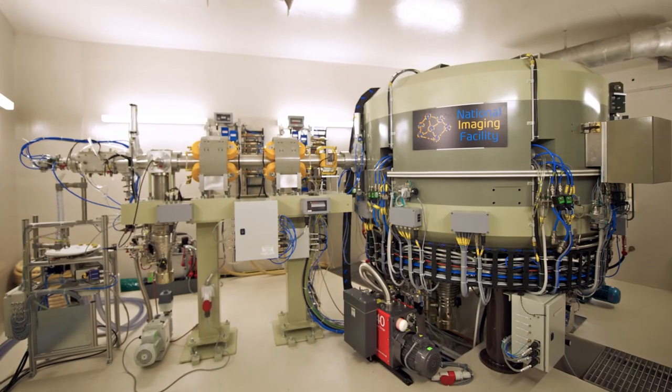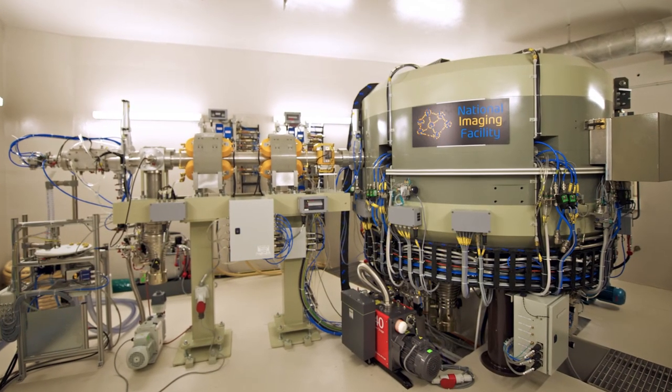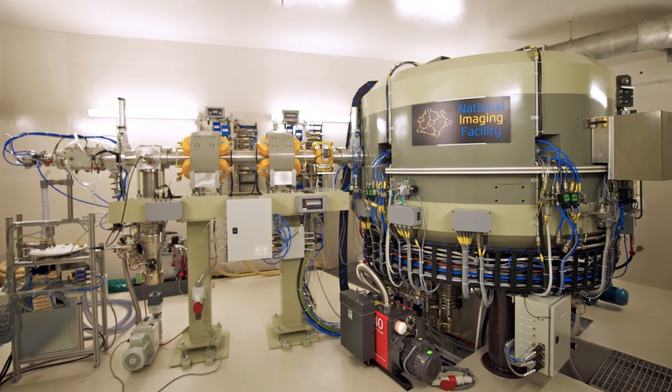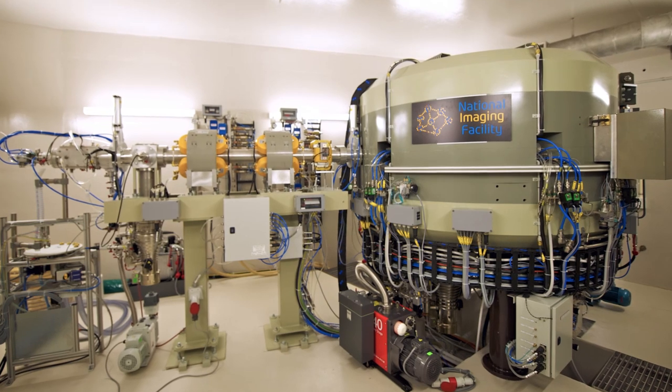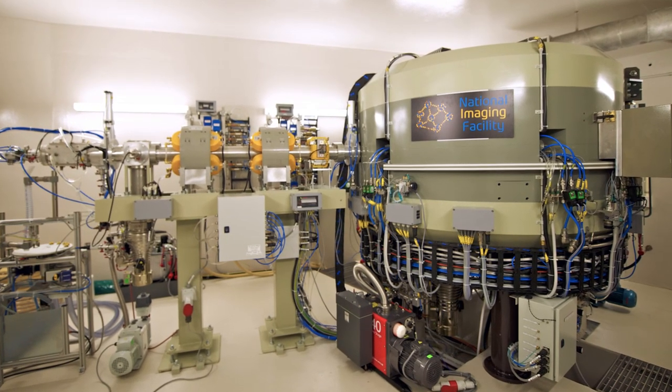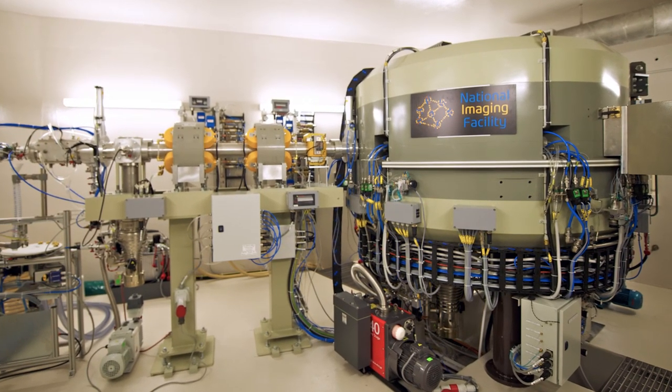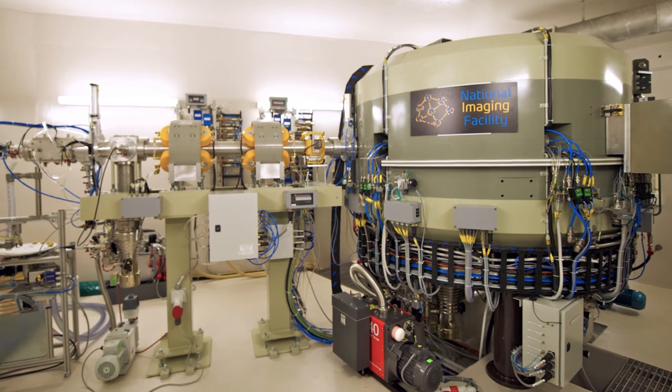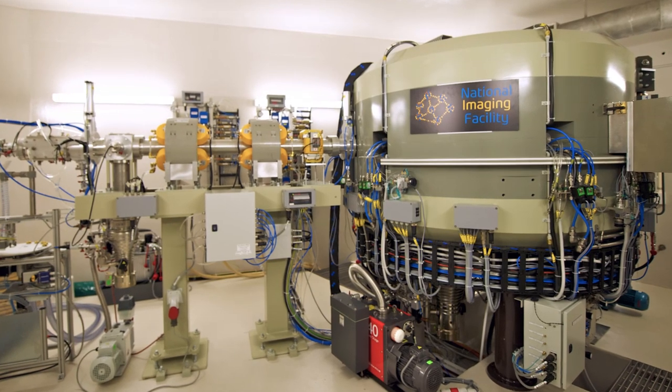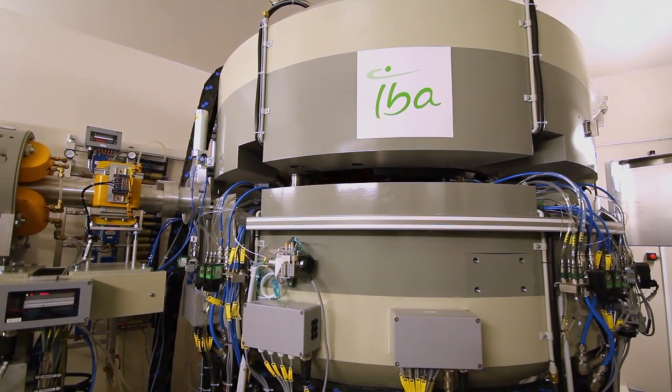This cyclotron was designed and manufactured in Belgium and is a fixed energy machine that accelerates negatively charged hydrogen ions up to an energy of 18 megaelectron volts. It has a weight of approximately 20 tonnes.